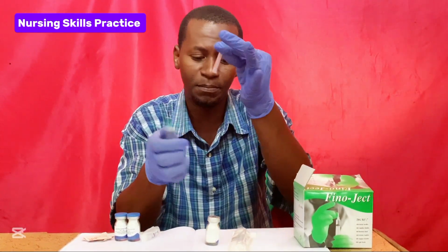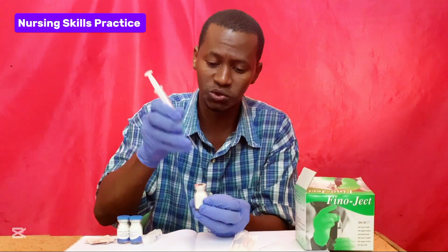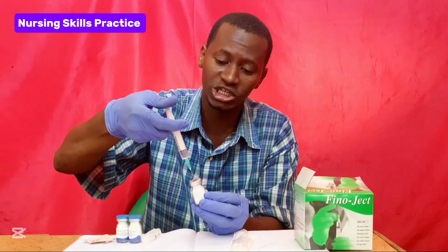You remove the cap of the needle. Then you inject it into the vial slowly. Then you have to transfer all the sterile water for injection into the vial.